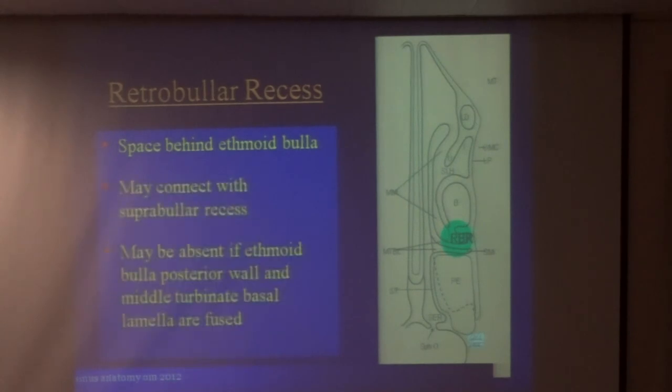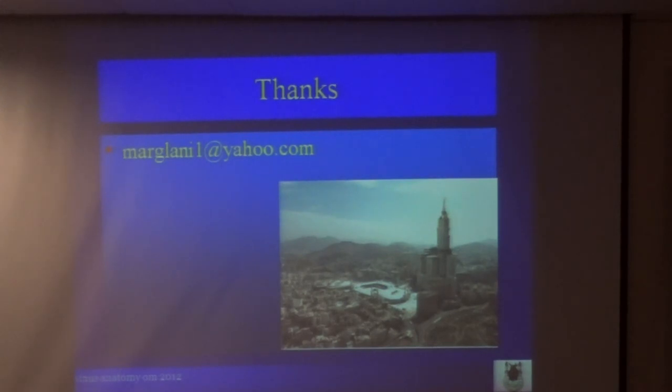Just a last point about the retrobullar recess behind the bulla itself. We can see this while we are doing the endoscopic anatomy. Thank you very much.